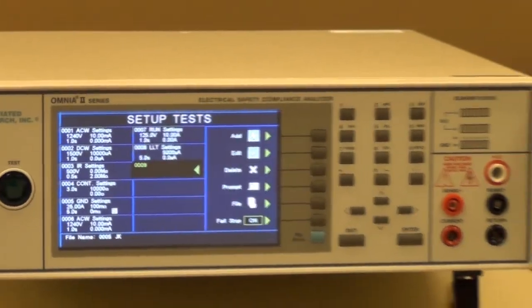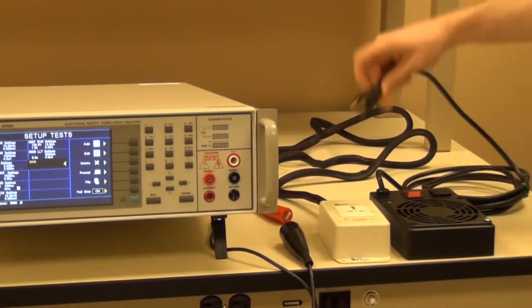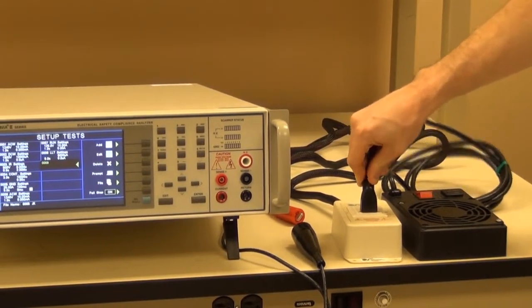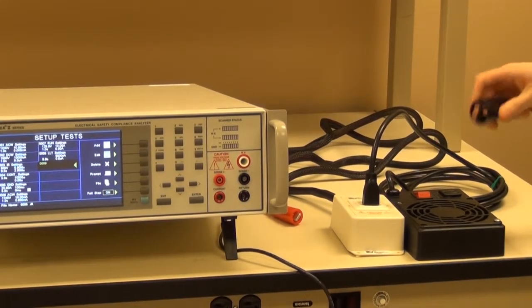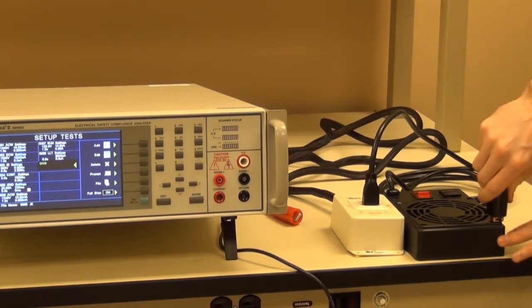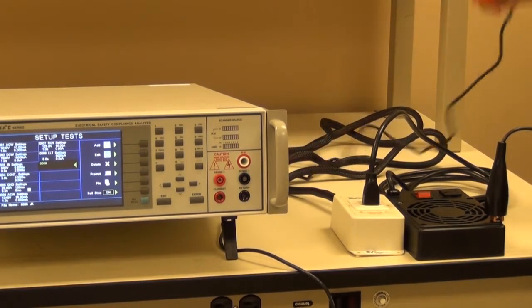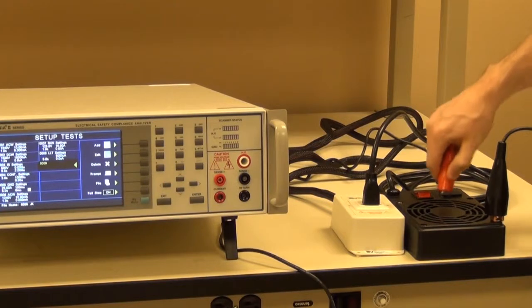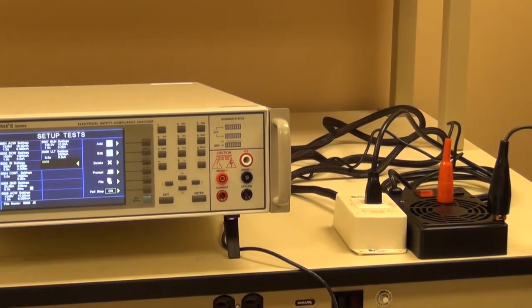Now we're going to make our connections to the DUT. First, I'm simply going to plug the 3-prong product into the adapter box. Next, I need to have a return point for my high pot ground bond and continuity tests, which will be the chassis point of the product here. Finally, for the line leakage test, I'm going to be doing one probing point on the enclosure of the device, so I'm going to connect probe high to the chassis as well.